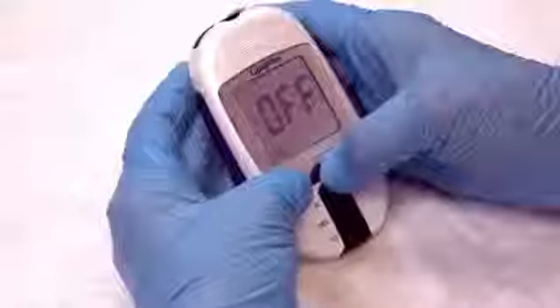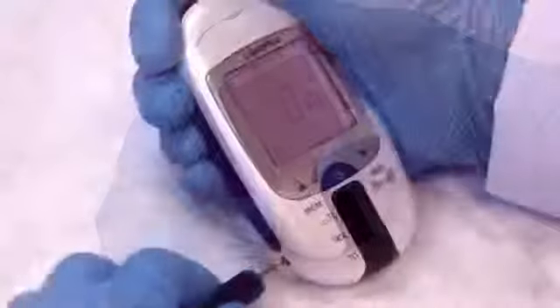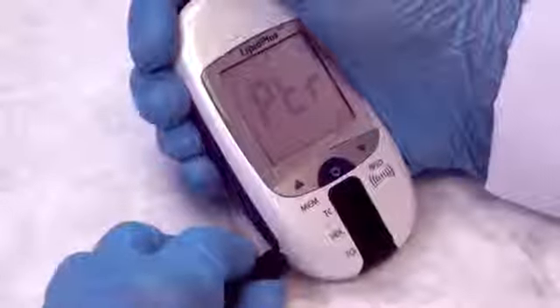If you are using a printer, be sure that the printer setting in the analyzer is turned on. The printer should be turned on prior to connecting the LipidPlus analyzer and printer with the interface cable.